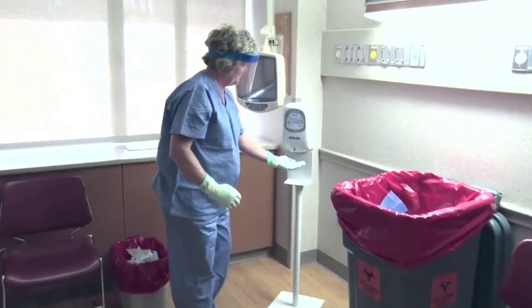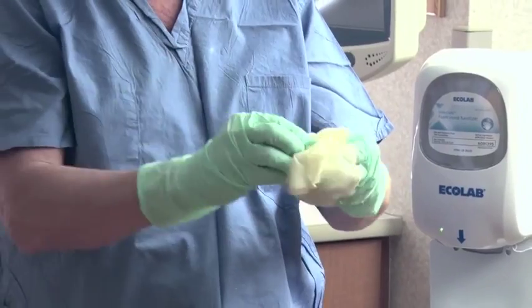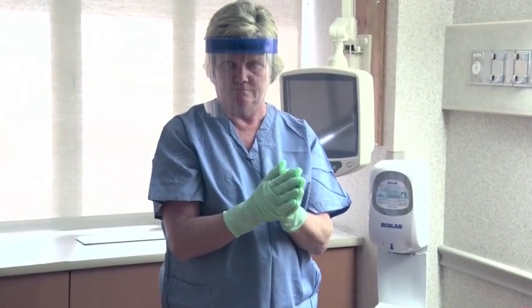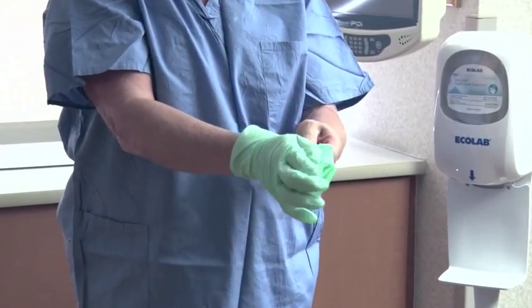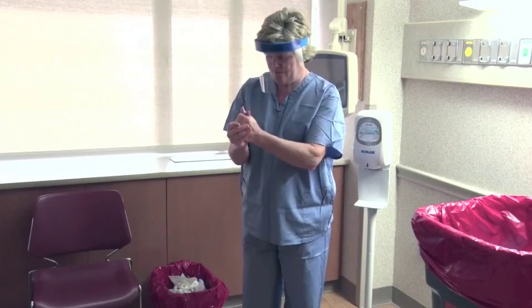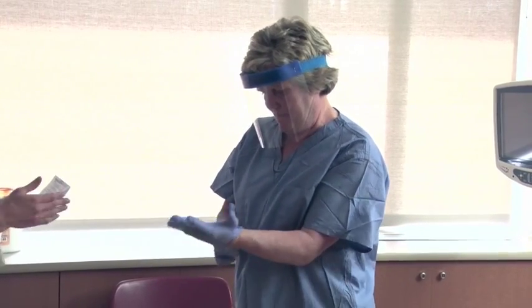Inspect and disinfect outer gloves. Remove outer gloves using the glove-in-glove technique. Inspect and disinfect inner gloves. If inner gloves are visibly soiled, cut, or torn, then remove the inner gloves, perform hand hygiene on bare hands, and don a new pair of clean blue nitrile exam gloves. Remove inner gloves using the glove-in-glove technique. Perform hand hygiene. Don a new pair of inner gloves — the blue nitrile exam gloves. It is best to wait until your hands are completely dry before applying the new set of gloves.